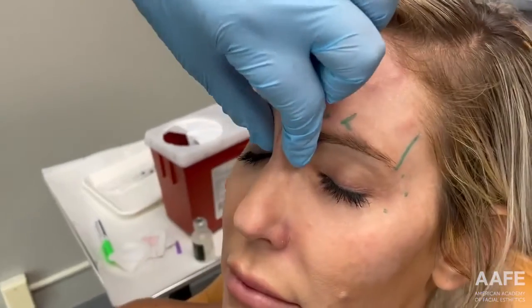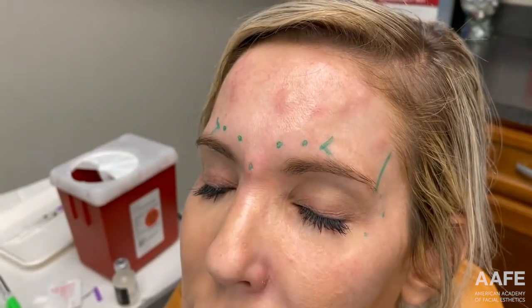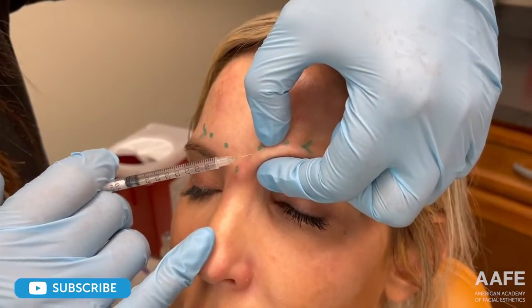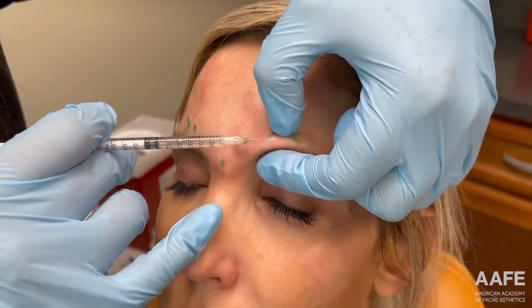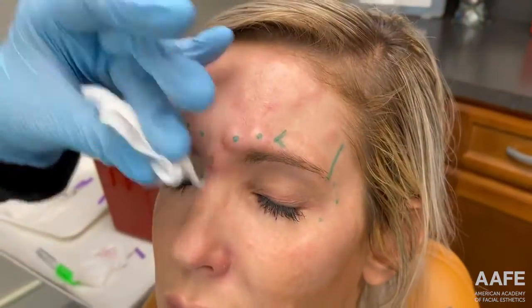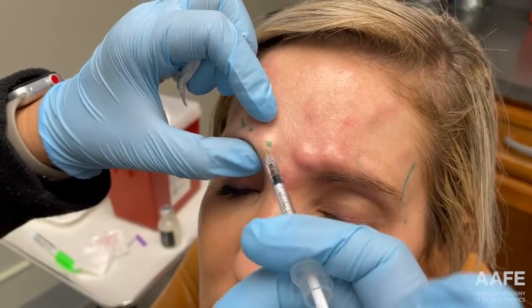When we're treating the procerus, you can see truly how thick this muscle is. So I always like to go full depth there just to make sure we treat all of the muscle fibers of the procerus. And then it's really important that we're using good injection technique in the corrugators. The reason I'm using this sort of 2-finger hold is I'm using my pointer finger here to block the orbital rim to prevent product from migrating down to the levator palpebrae superioris. This is the muscle that's responsible for keeping our eyelids open. And so when you have product migrate down to that muscle, you can develop lid ptosis, which is ptosis of the eyelid. And we want to avoid that at all costs.